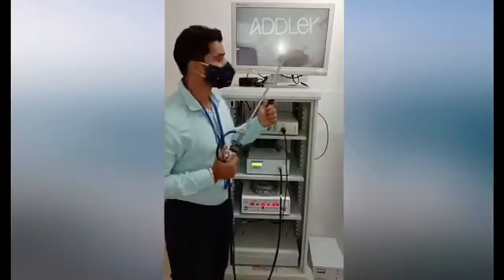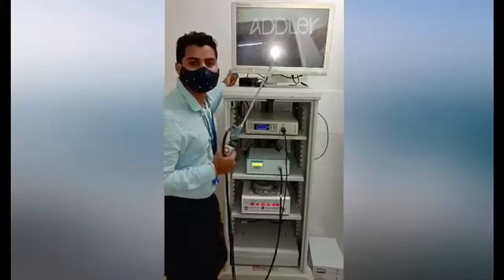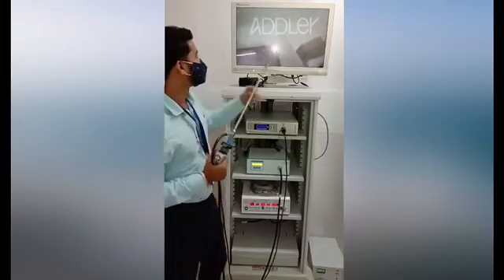Welcome to Adler's demo on the Stryker 1188 system. We have the Stryker Wyze monitor here, with a full HD LCD display, with various input-output modes, and it can also be connected to the Stryker wireless transmitter.